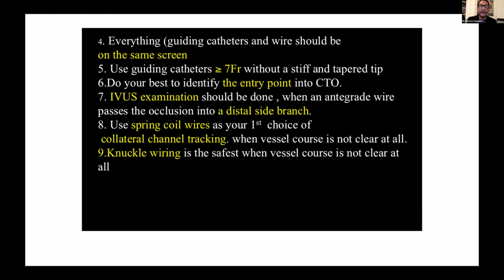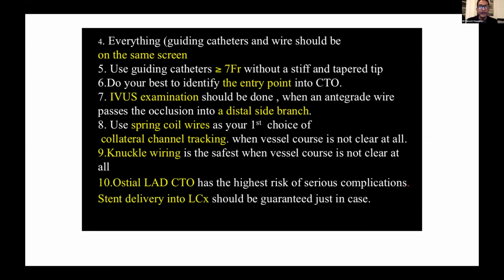And knuckle wiring is the safest when vessel course is not clear at all. And Omer prefers parallel wire, that also could be done. Ostial LAD CTO has the highest risk of serious complications. And so I would not say that beginners should start with an ostial LAD CTO.